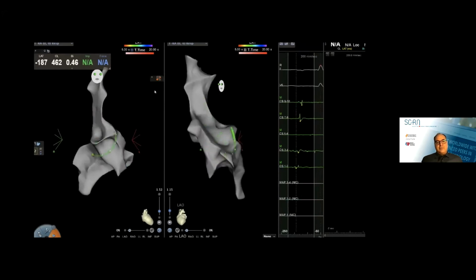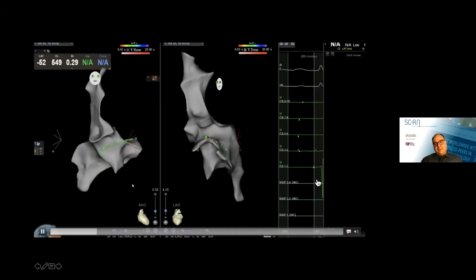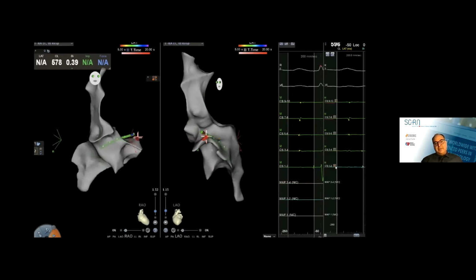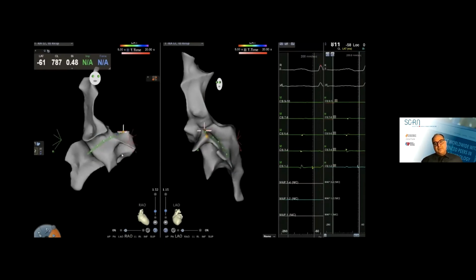Slowly go to the right atrium. Obviously, since you don't have ICE guidance, you just have to be gentler and mindful of the structures. And you look for things that you usually need to put your catheter in. So His, for example, as you can see, I'm mapping for the His on the septum. This is right bundle showing up here. Pull the catheter back, again, create a nice His cloud. That's beginning distal His. That's sort of proximal His there.